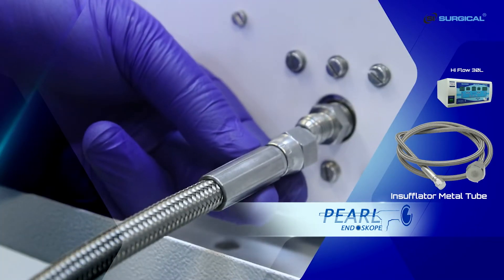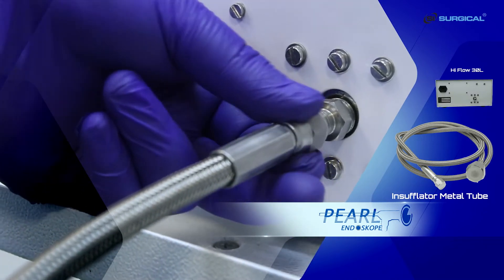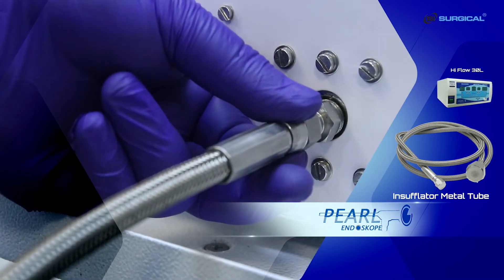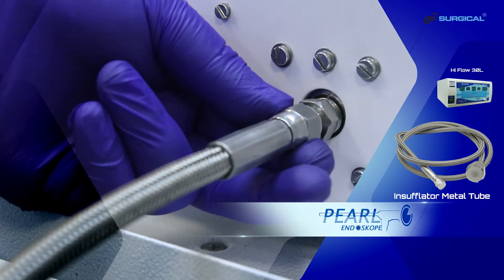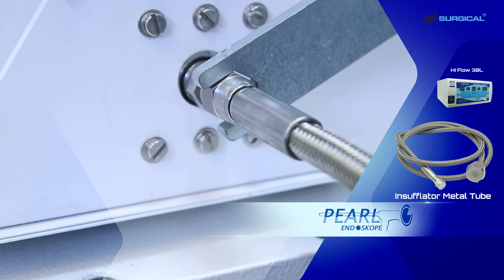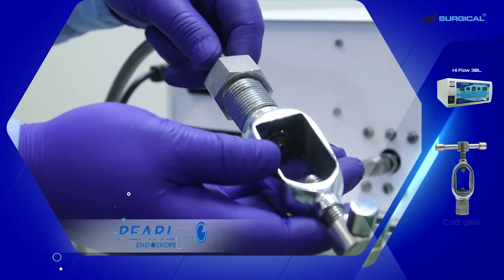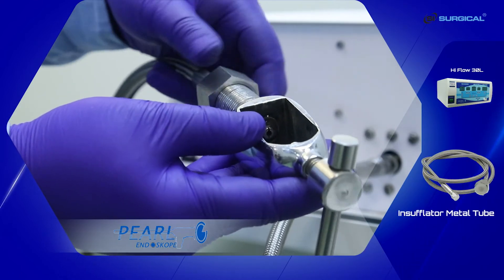This side is connected as shown. It is connected properly with the use of this wrench. The insufflator metal tube is connected to the CO2 yoke like this.